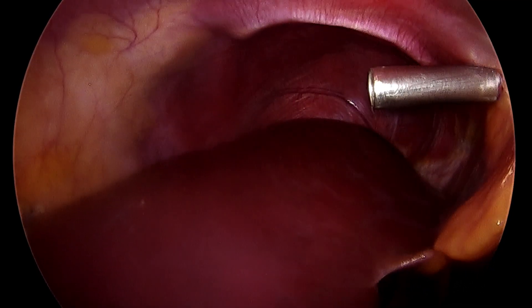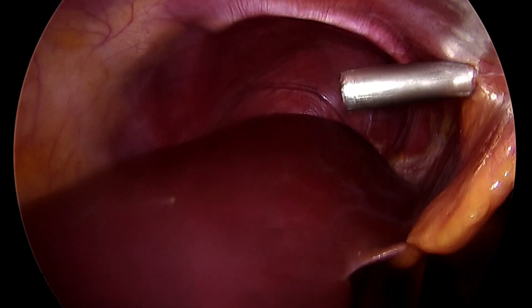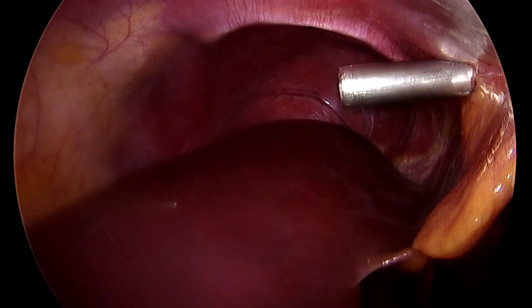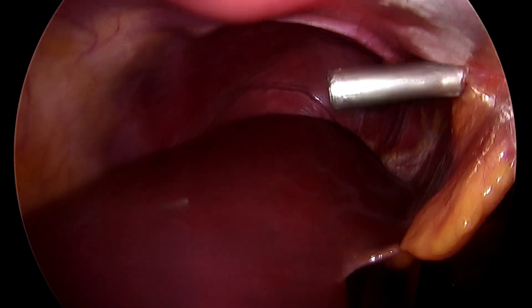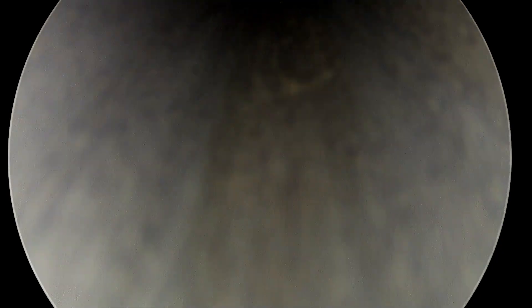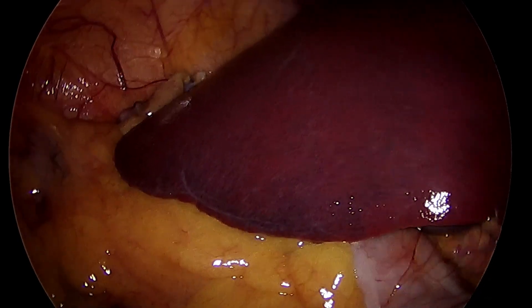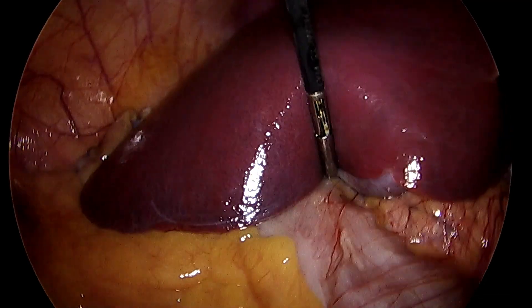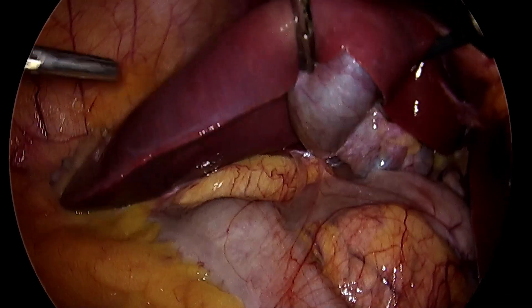Finally creating my left hand port — that is the right subcostal port. Adjusting the focus a bit.